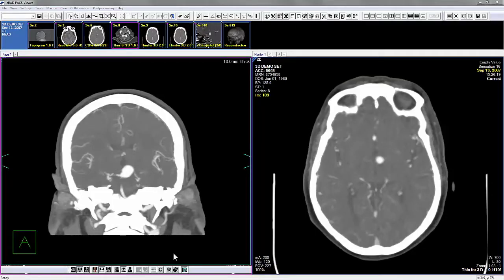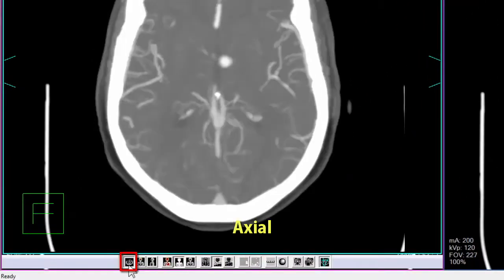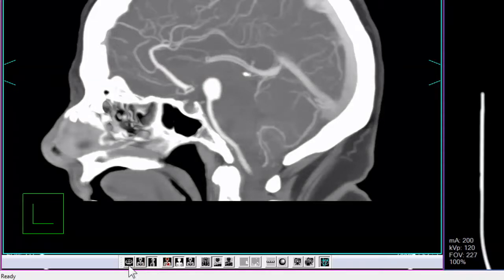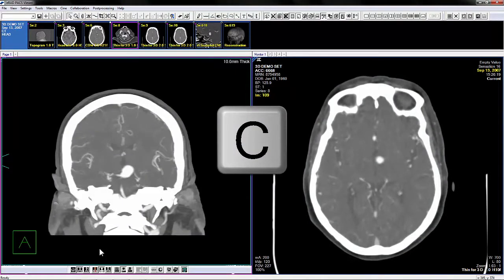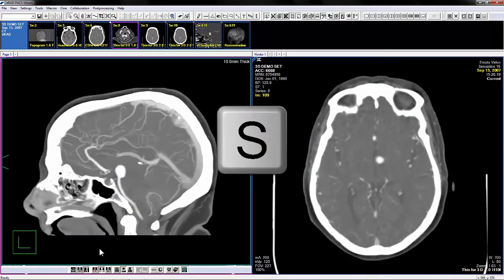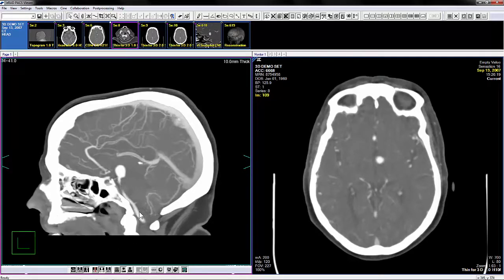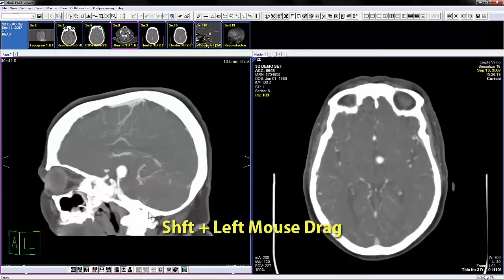Display orientation can be controlled in multiple ways. Click the orientation preset icons on the plug-in toolbar — options are Axial, Coronal, and Sagittal. These orientation presets can also be invoked with keyboard shortcuts: A for Axial, C for Coronal, and S for Sagittal. Manual rotation and oblique angles can be achieved by holding Shift on the keyboard and doing a left mouse button drag over the image.